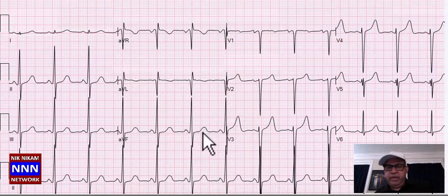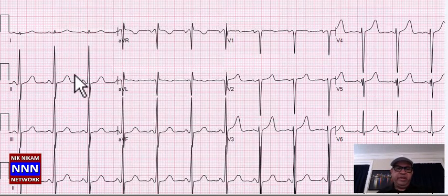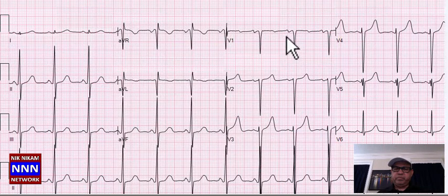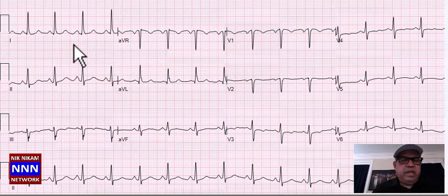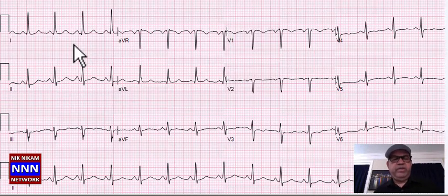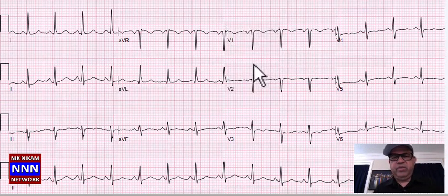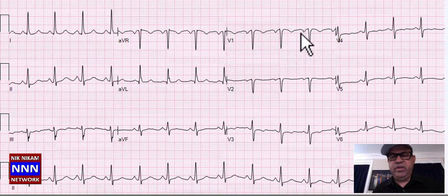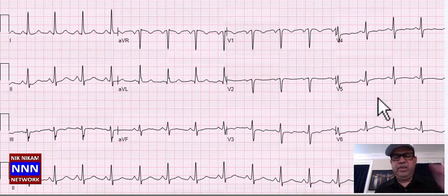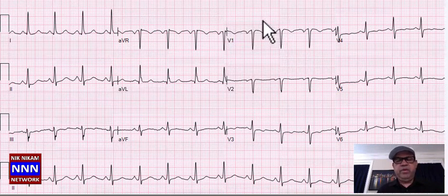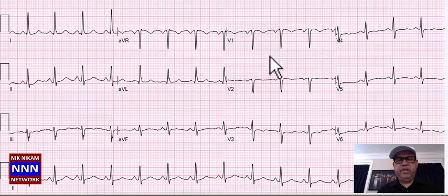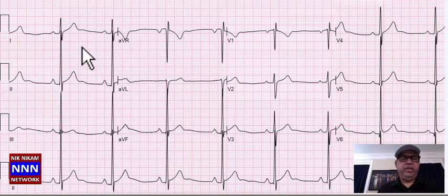Here we have sinus rhythm with increased voltage in the inferior leads, left atrial enlargement, and possibly left ventricular hypertrophy. Next: sinus rhythm with non-specific T-wave changes in the inferior leads, loss of R-waves anteriorly, left atrial enlargement, non-specific ST-T changes in the lateral leads — probably a coronary artery disease patient with old anteroseptal myocardial infarction, left atrial enlargement, and non-specific ST-T changes.